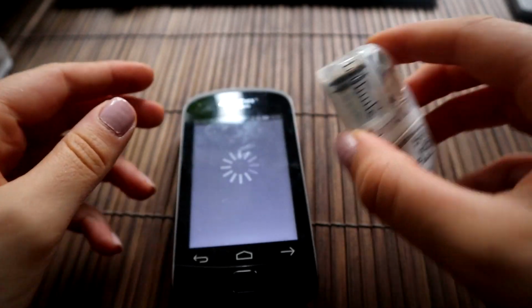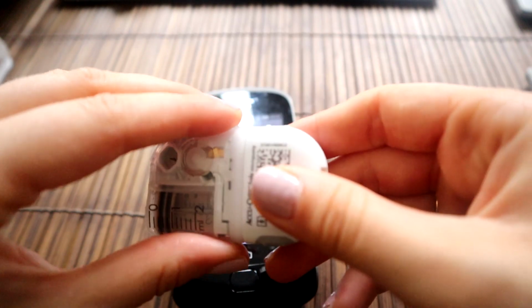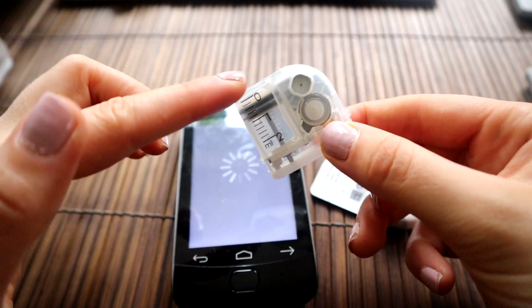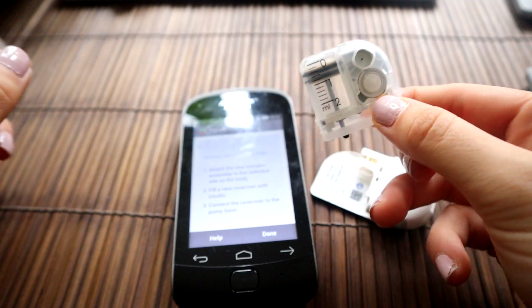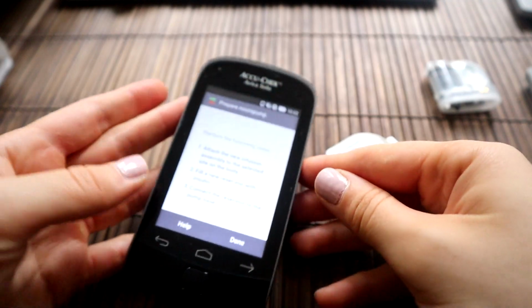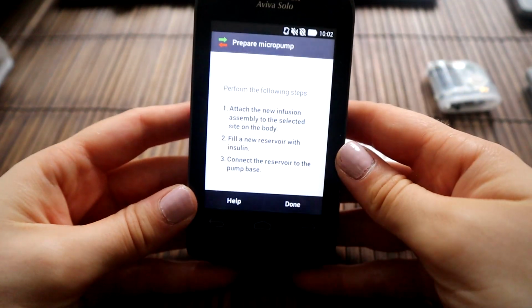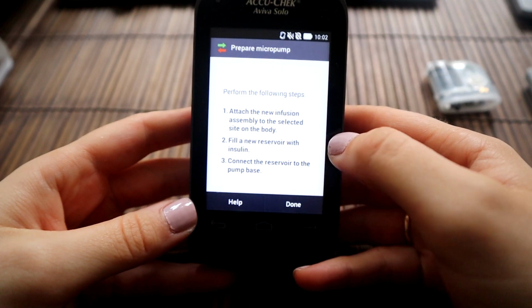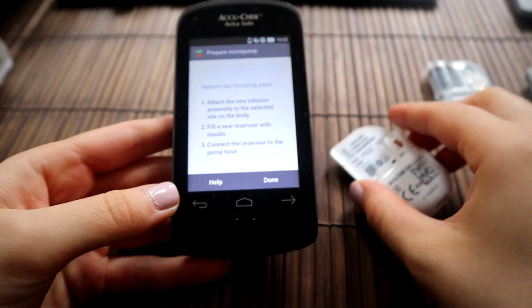So obviously my old infusion assembly, I'm going to chuck in the bin. We take this off. This whole reservoir gets binned. You can see I've still got like 19 units of insulin in here, but it will just have to go in the bin. So then it says attach the new infusion assembly to the area on the body, done. Fill the new reservoir of insulin. So now we get to the reservoir filling.